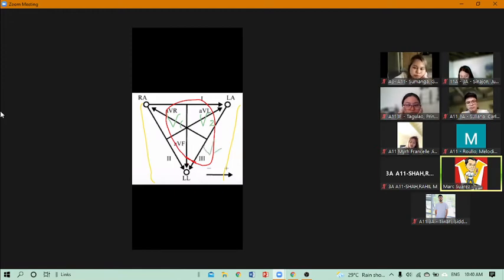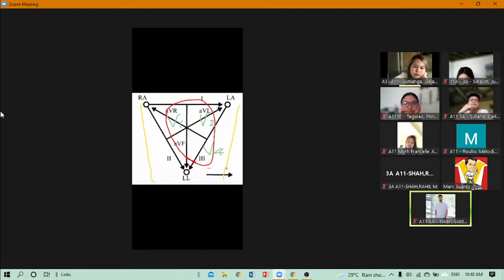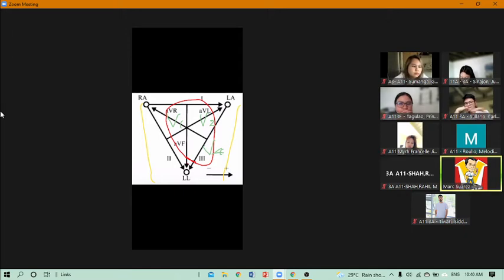So at this point, follow? Yes. How about V3? Midway, Doc, of V2 and V4. Very good. So V3. Does everyone follow? So mid-clavicular line. Shall we proceed?